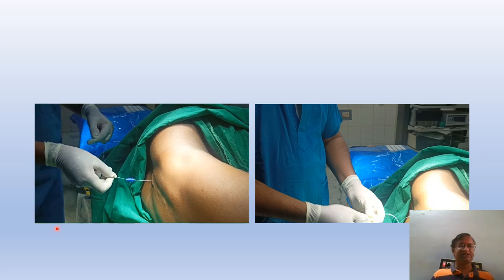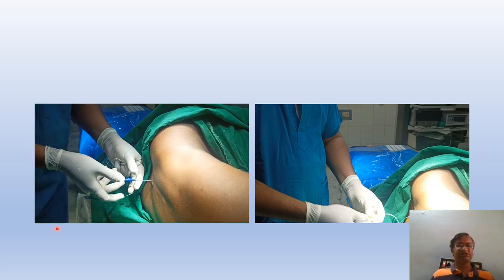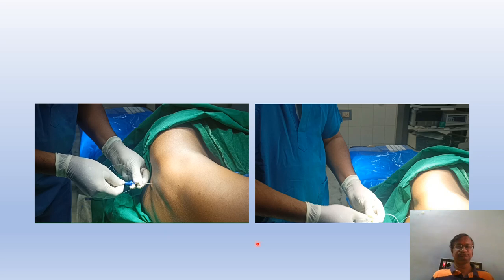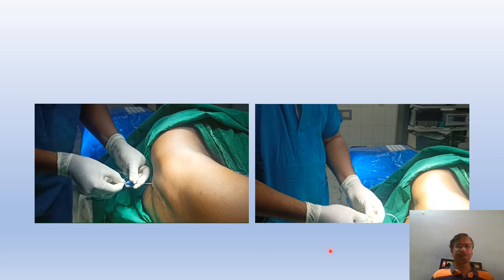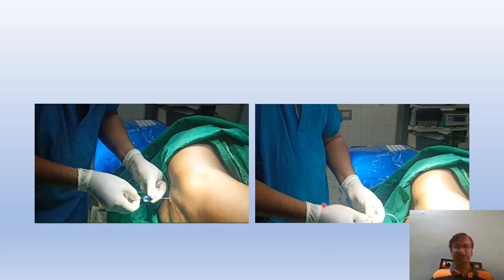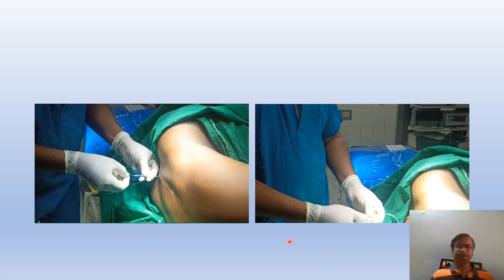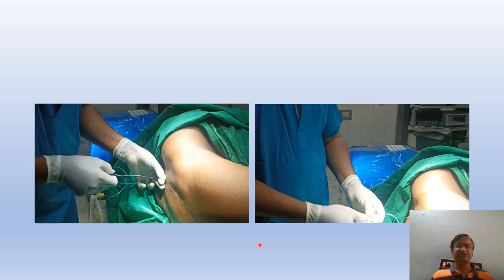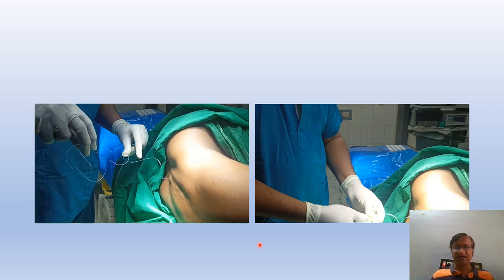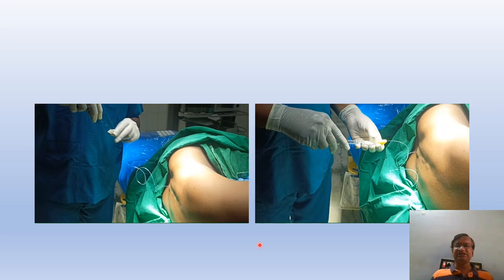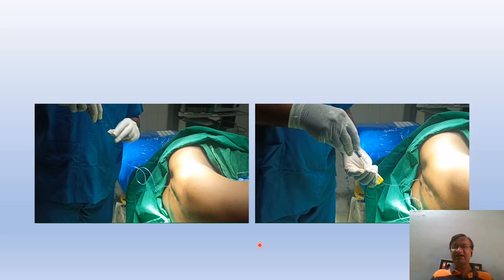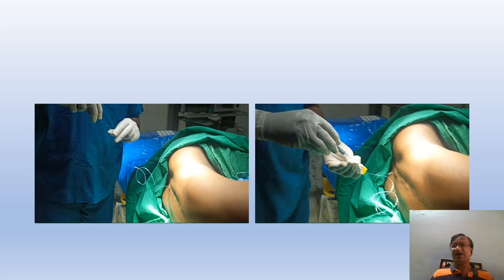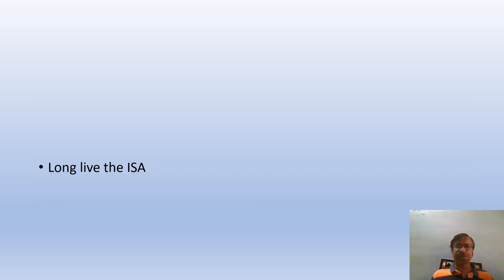Now I am inserting the catheter. The catheter insertion is completed within one and a half minutes. You can see I am attaching the syringe, aspirating, and then administering. If you had pre-flushed the catheter, the aspiration result would confuse you — that is why I do not pre-flush the catheter before insertion. Thank you.